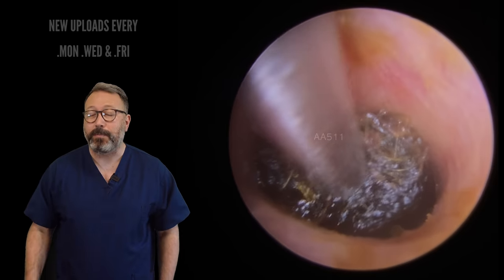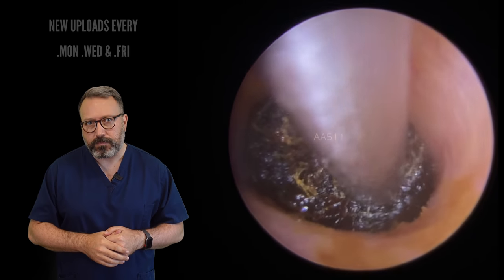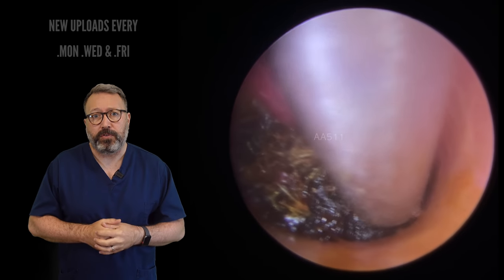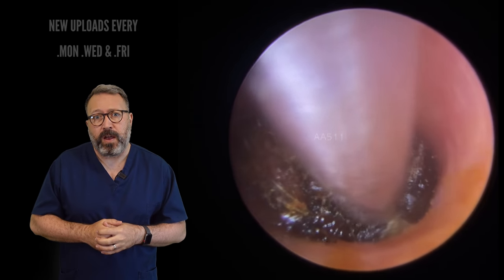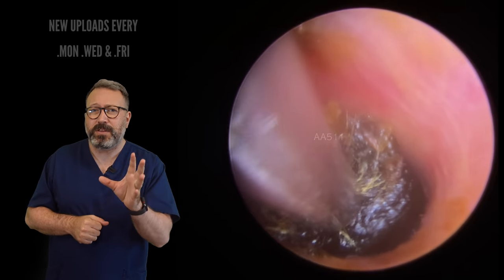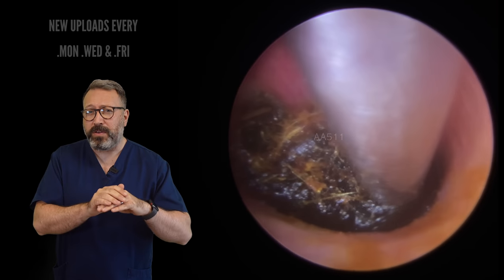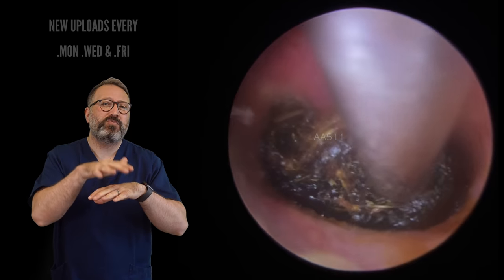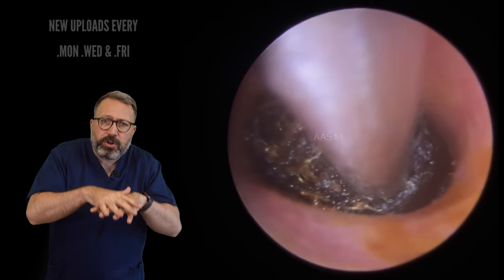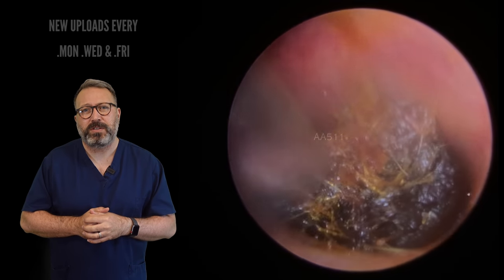There's very little room to maneuver. But what we've got is the standard size suction tube in here. I'm trying to hold onto this wax to maintain a suction grip whilst trying to move this back and forth. But you can see it is very, very well lodged in here. The patient, by the way, was an absolute diamond — they did so well to sit through this. This can sometimes be a little bit uncomfortable because the skin sitting this deep in the ear canal is very, very thin. It's sitting almost directly on top of bone, so there's no fatty tissue underneath. There's no spring to the skin, so if you push on it, it can feel like a sharp scratch. So this patient was doing extremely well, but just so desperate to get this out.